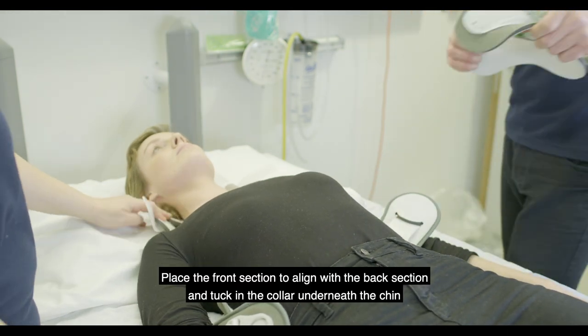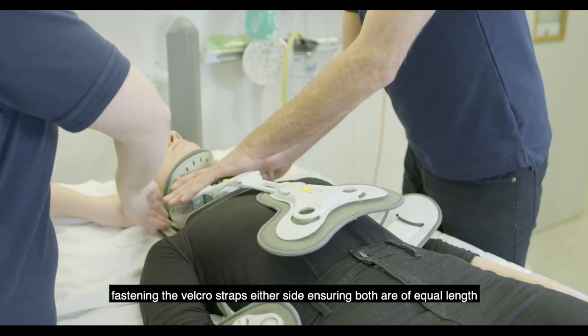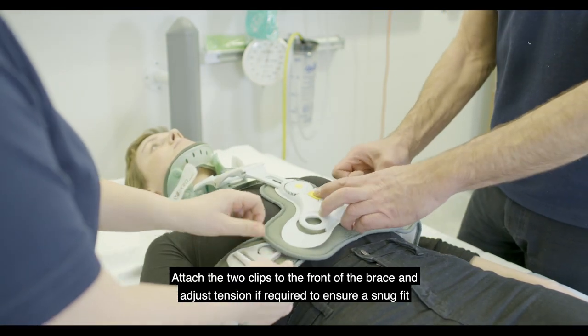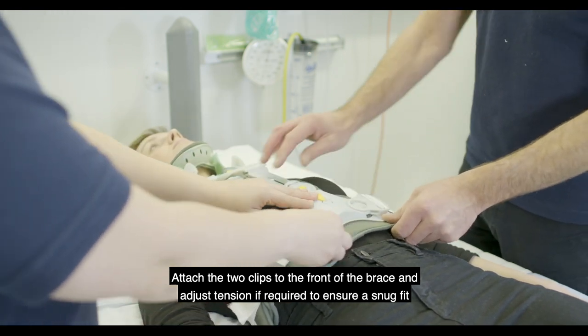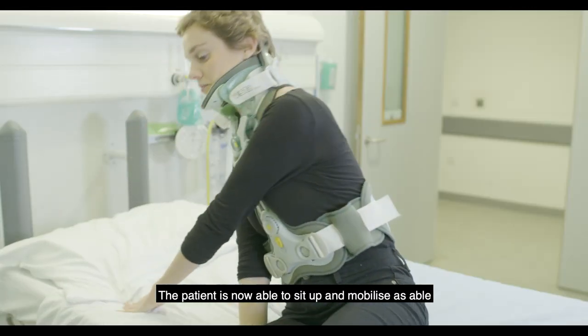Place the front section to align with the back section by tucking the collar underneath the chin and fastening the Velcro straps either side, ensuring both are of equal length. Attach the two clips to the front of the brace and adjust tension if required to ensure a snug fit. The patient is now able to sit up and mobilise as able.